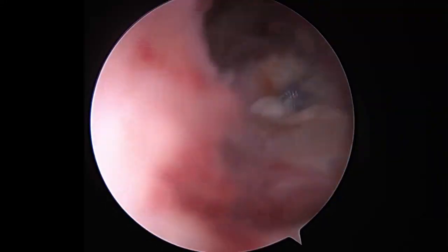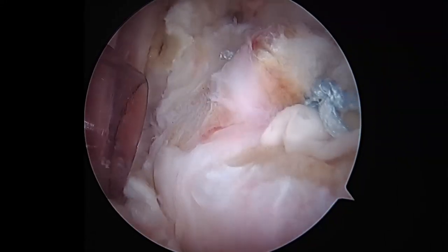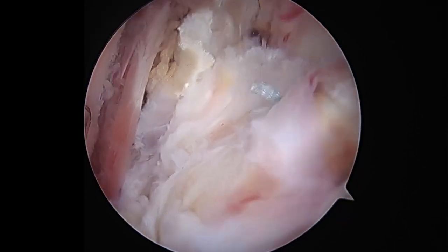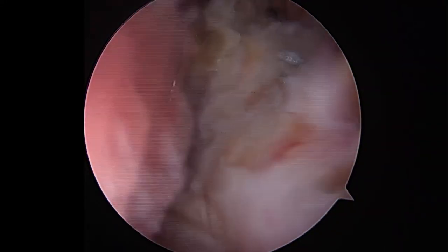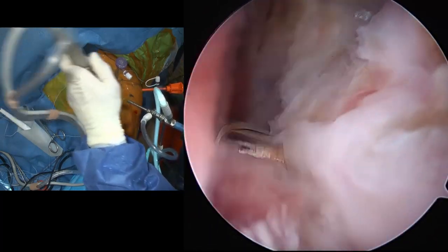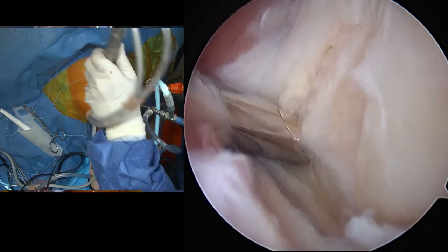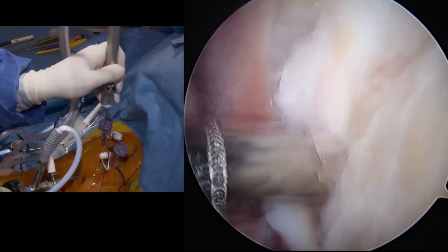So good, all right. Let's just find the biceps to make sure it's freed up. Shaver, got it. Let's go down the front here. Sometimes when we do a lot of work at that front corner, I get worried that I may have trapped the biceps. So I want to make sure the biceps tendon comes out before I go in the subacromial space. I don't want to rip anything. So we'll just find it real quickly down here.